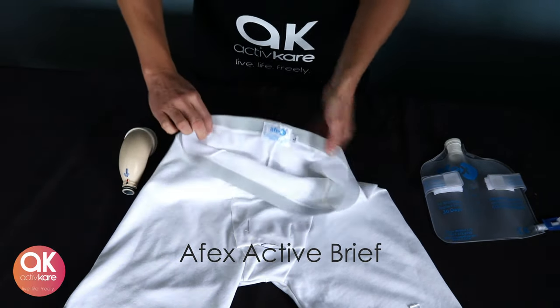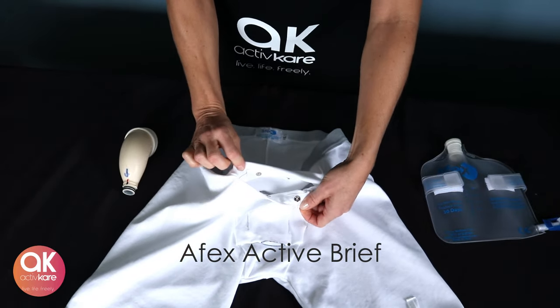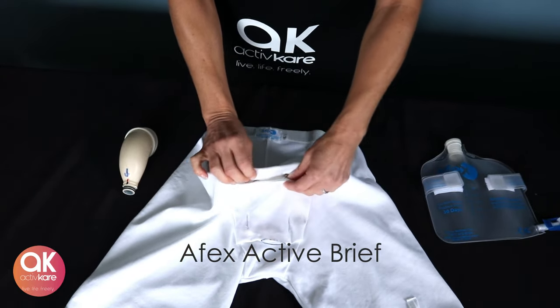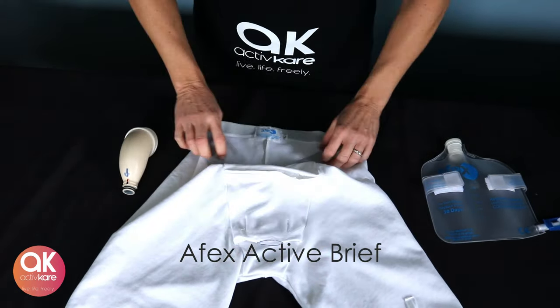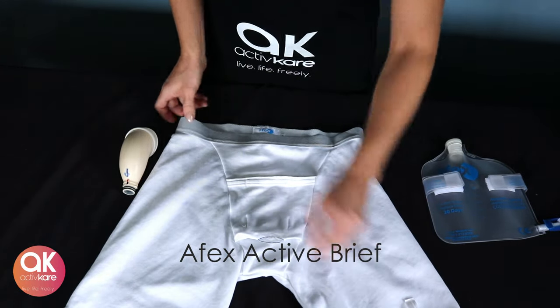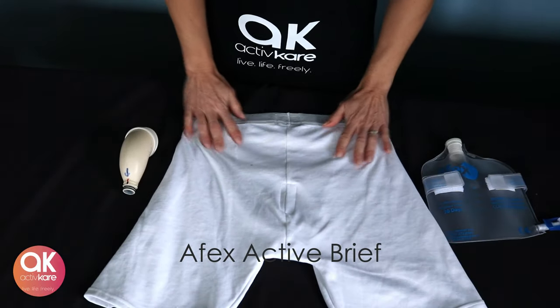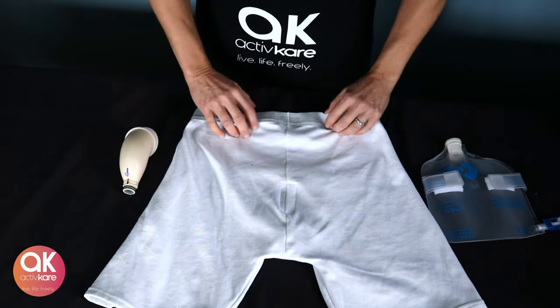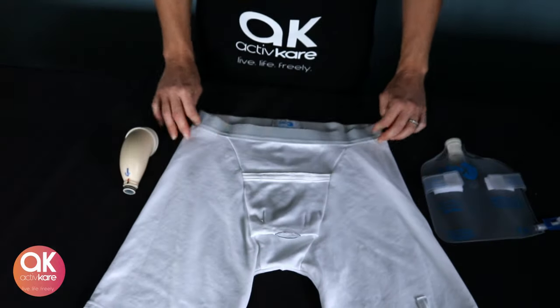The 98% cotton brief has a double snap front, triple stitched opening for the bottom of the penile receptacle, safety loops for collection bag attachment, and inside the back of the briefs is a velcro strip for attaching the overnight reusable pad.